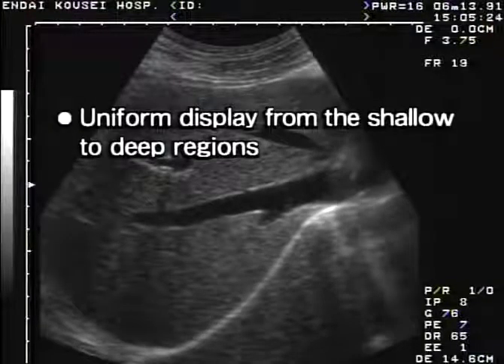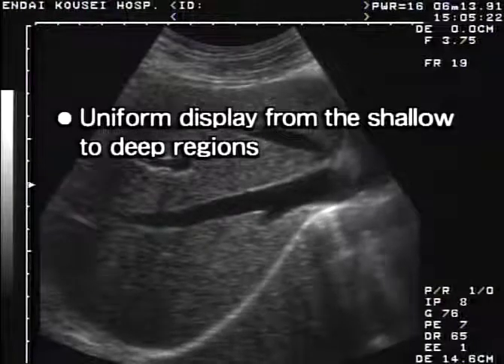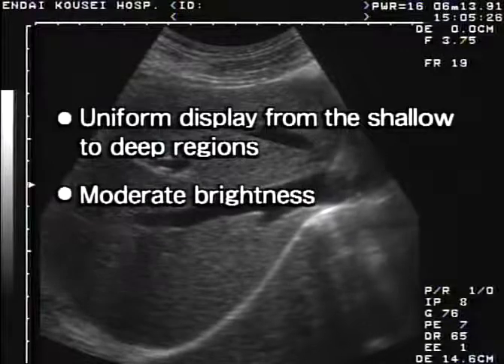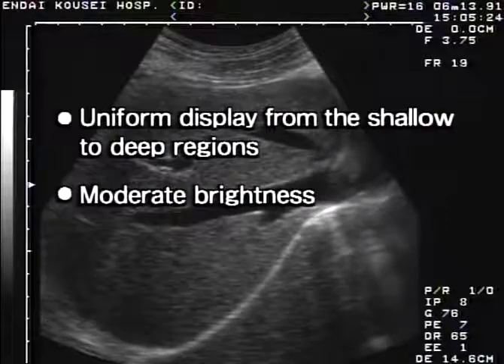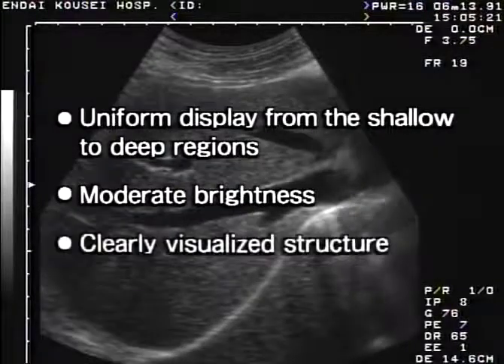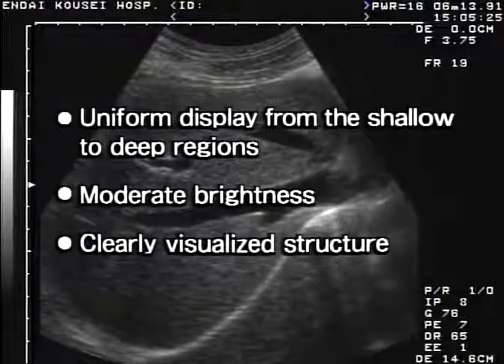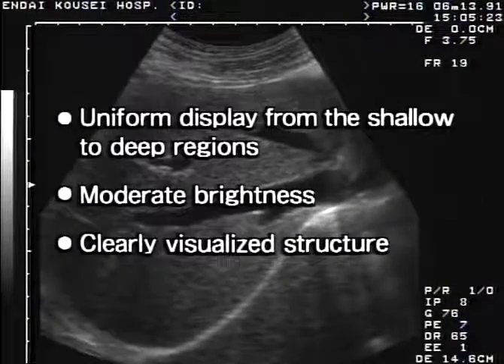First of all, echoes from the shallow to deep regions must be represented with almost the same intensity. Second, the screen should be moderately bright, but neither too bright nor too dark. Finally, the vascular walls and gallbladder wall should be visualized clearly, and parenchymal structures should be uniformly displayed.